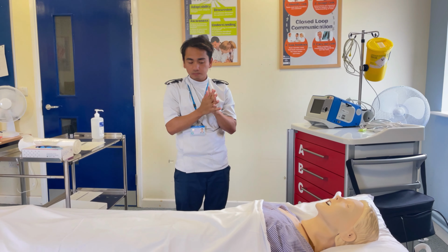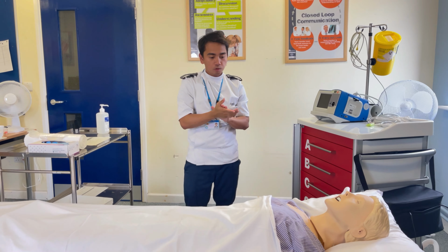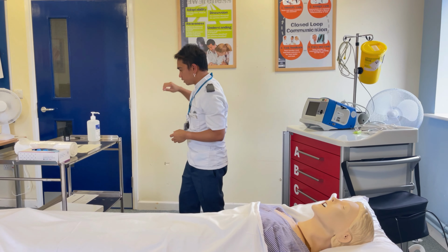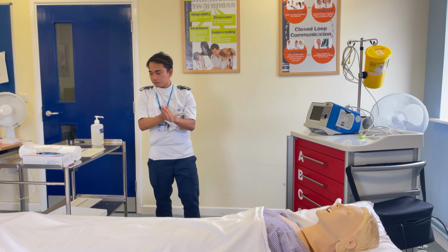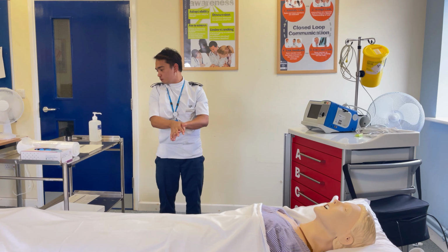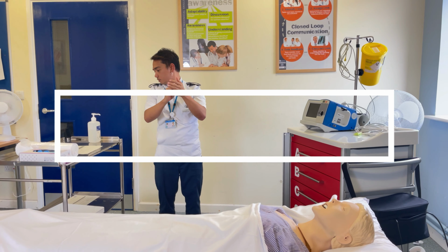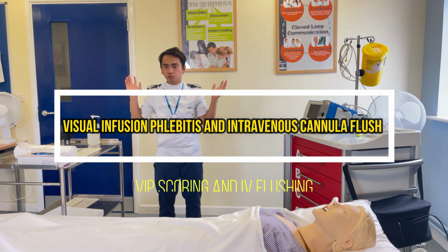No. Are you comfortable? Yes. All right then. Thank you so much for your cooperation. Do you want me to open the curtain back again? Okay. I'll open the curtains, and I'm going to end my station with 7 steps of hand hygiene. 1, 2, 3, 4, 5, 6, 7. And let me hand dry.